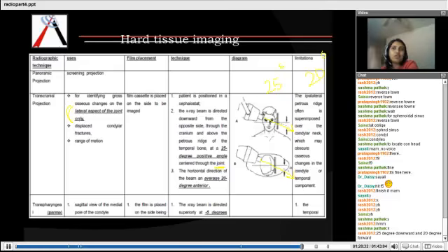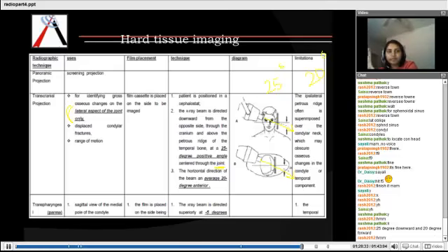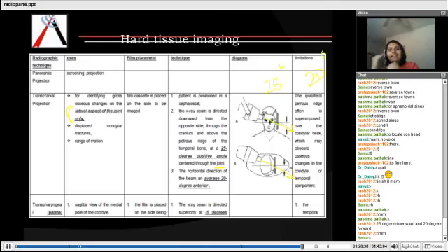This is the whole sentence that will describe it. Isn't it 25 degrees downwards, 20 degrees forward, above the petrous temporal ridge, through the condyle of interest? Clear?